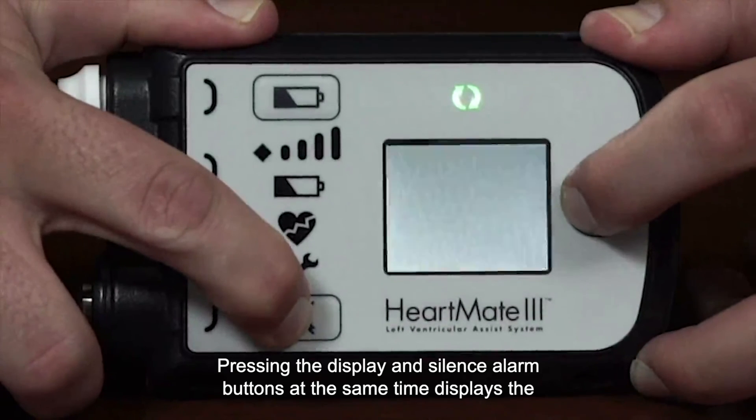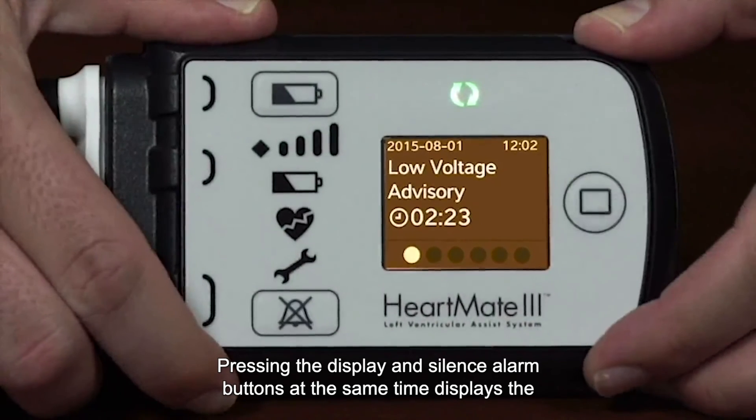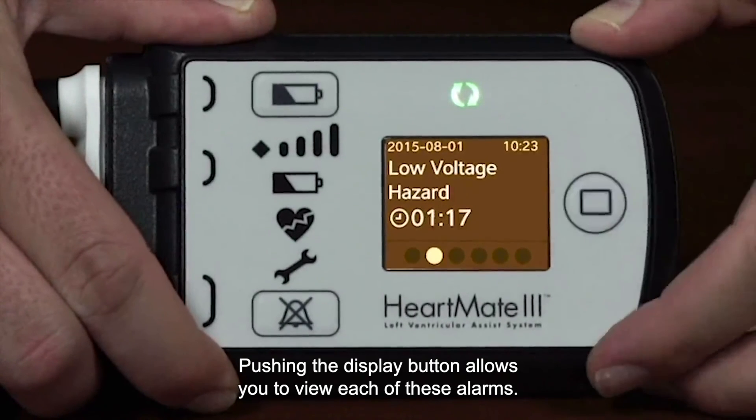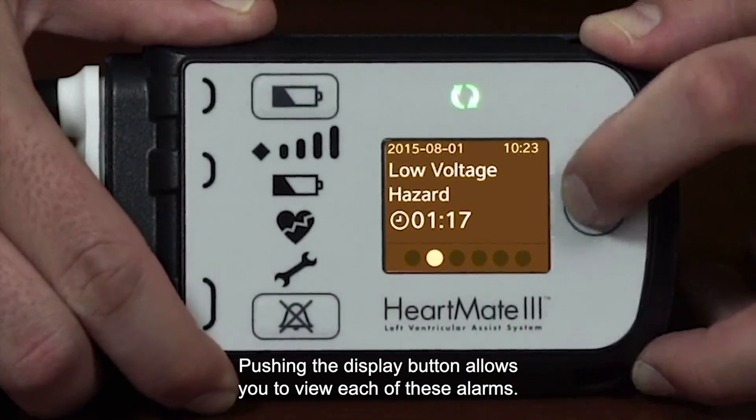Pressing the Display and Silence Alarm buttons at the same time displays the last six alarms stored in the controller. Pushing the Display button allows you to view each of these alarms.